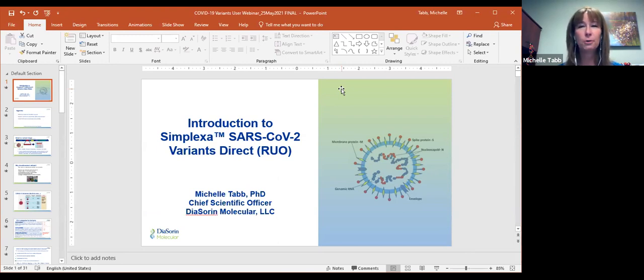Every instrument has its own particular qualities. And this is why, if you look at our instructions for use, you'll see a melting temperature range associated with each of those channels, even for the positive control. And really, as long as the positive control is on the run for you to compare your clinical specimens with, that should help anchor your results. So you could see those Tm differences of the clinical specimens with reference to that positive control.